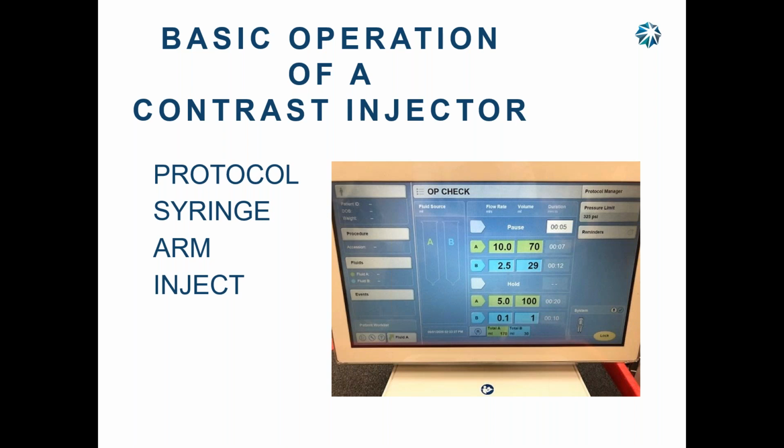Basic operation of a contrast injector. What's a protocol? Just the word protocol. A set way of doing things. Okay? So now taking that off, I call the protocol your recipe for your soup. Okay? Your protocol, you're going to put the ingredients in the soup to make your final outcome.